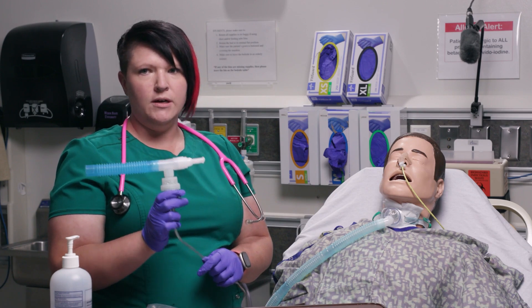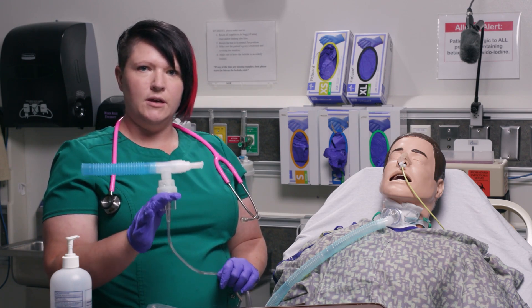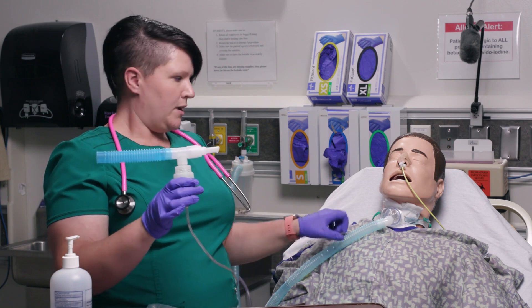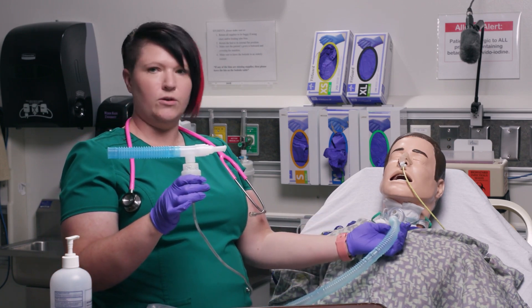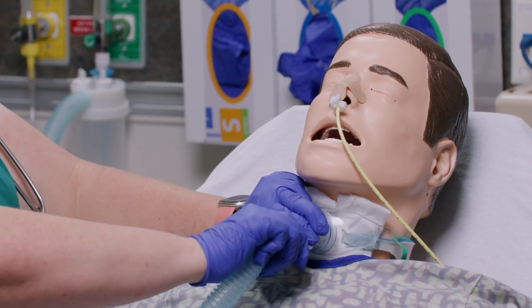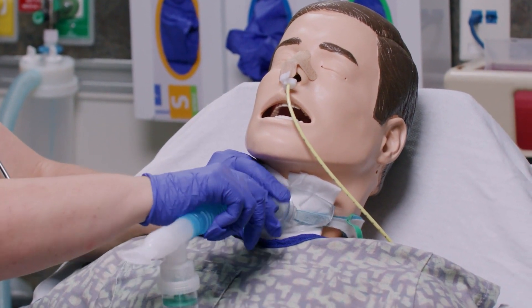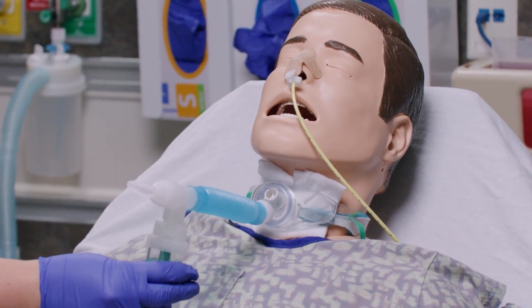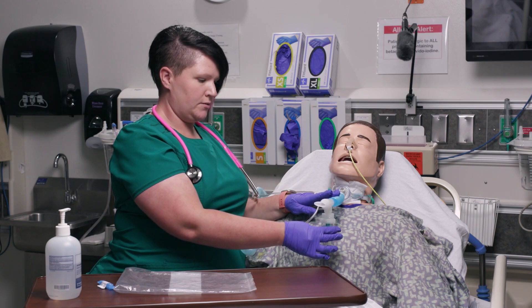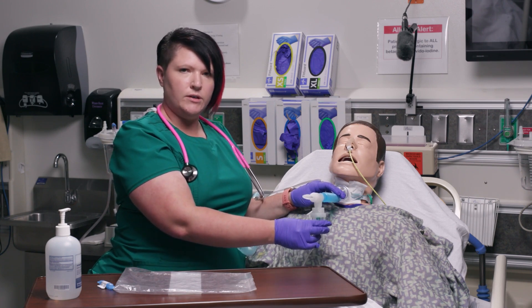Now I'm going to show you how to connect this nebulizer to a trach patient. Everything up to this point is the same, but because they have a trach they cannot breathe through their mouth and nose — we have to utilize the trach. I have my patient who has a trach mask. The corrugated tubing needs to be removed and connected to the trach. This patient is connected to oxygen, so you always want to use oxygen.